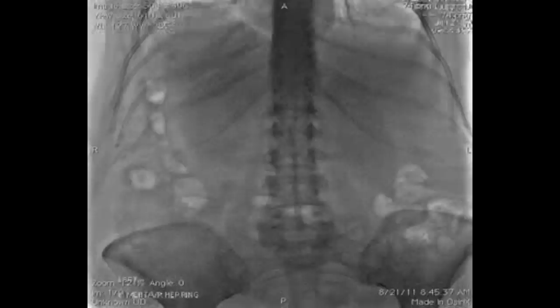The case being shown today is a 66-year-old woman who suffered an iatrogenic distal ureteral ligation, as shown here by her antegrade nephrostogram.